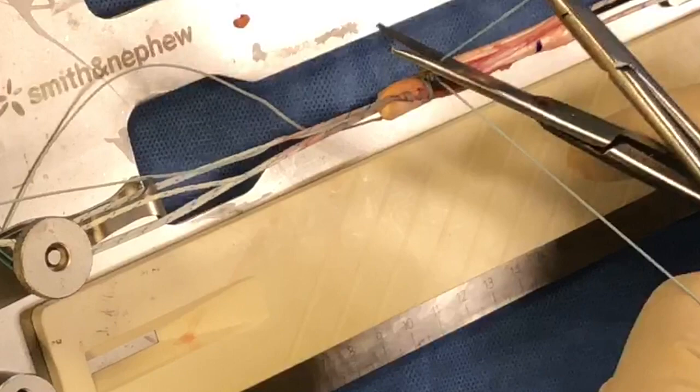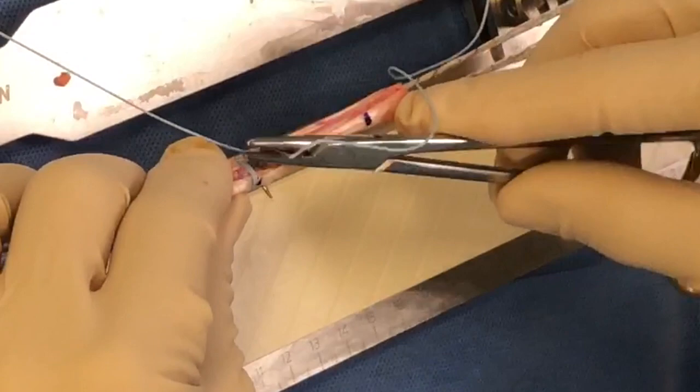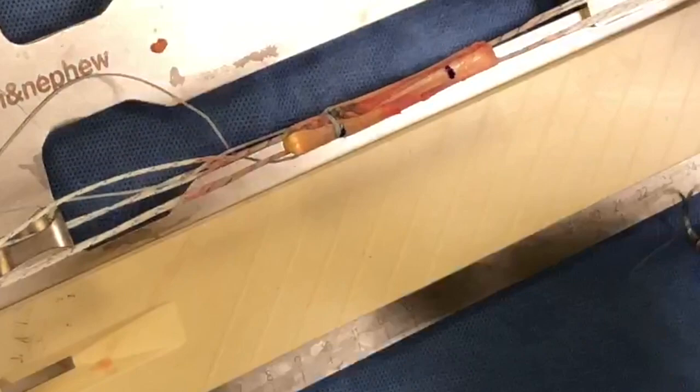To bring the knot through the graft, pass it back down through the gap, through the other side, pull tight — and that brings the knot down into the body of the graft. Then you simply cut that off. You proceed with the other side and do exactly the same procedure on the other end. Here's the graft that's been prepared.